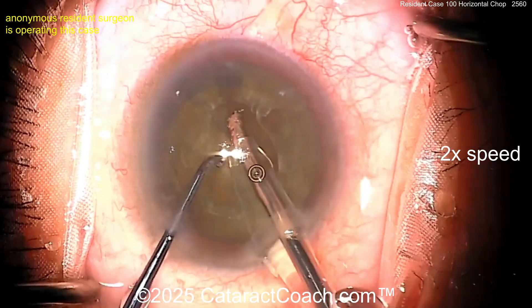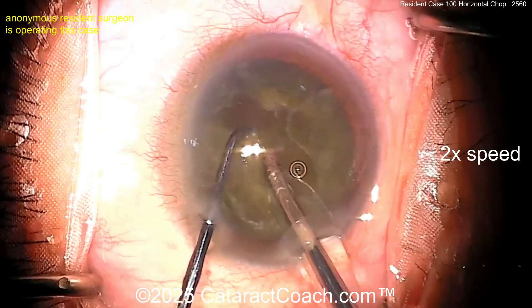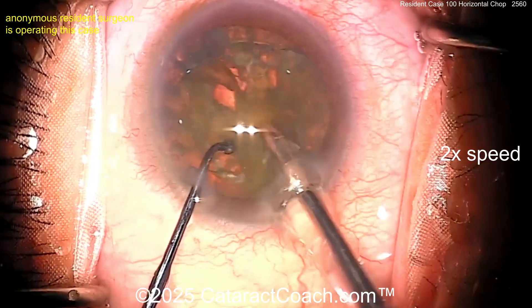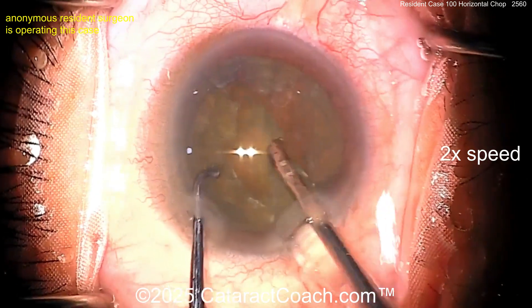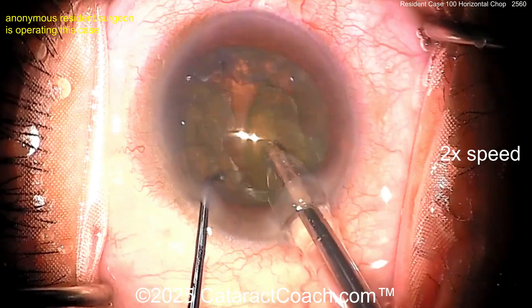Remember, these graded cases are always anonymous, so it's not like someone gets bonus points for a wrong case number — but I believe this is case 100. In years past, ten years ago this would have been case two or three hundred, and honestly twenty-five years ago this would have been case five hundred. The new generation really has the ability to learn so much more.